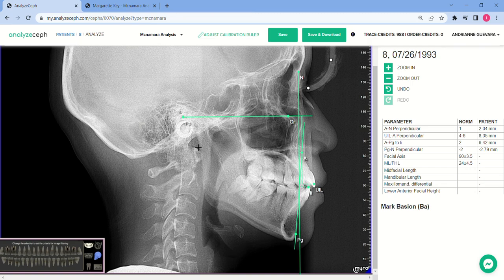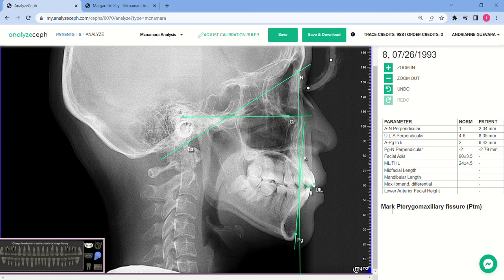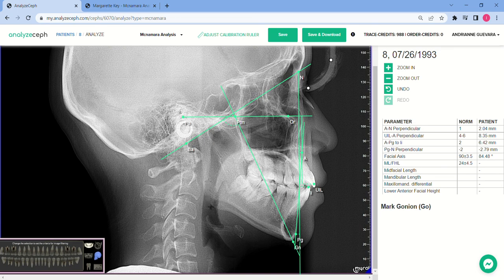Next, mark basion. As we are plotting the points, you may notice that AnalyzeCeph automatically measures the parameters required for the analysis. Let's continue. Mark pterygomaxillary fissure. Mark gnathion — today we're using the constructed gnathion.